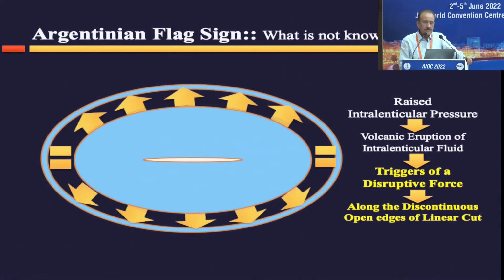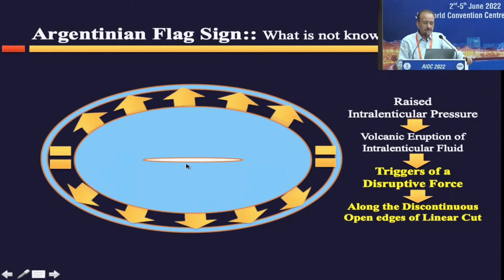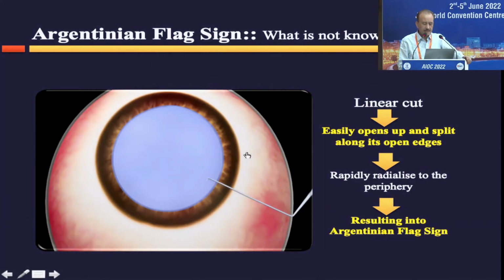And if you have a high pressure within the capsular bag, this linear tear would easily open up, because there is a tear already, and the high pressure will open up this tear to the periphery, and this tear would extend to the periphery in the form of the Argentinian flag sign. You can see this animation video, how this tear would extend. We have created a small tear. Now the high pressure will open up this tear into an Argentinian flag sign.